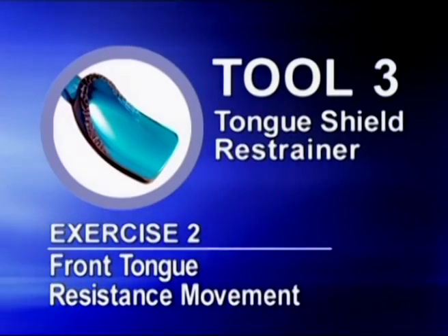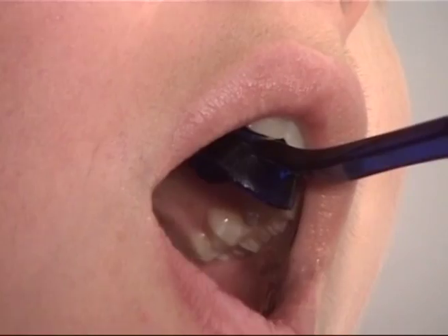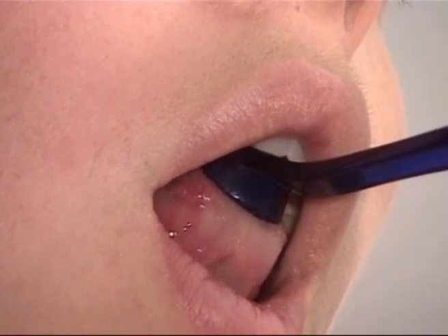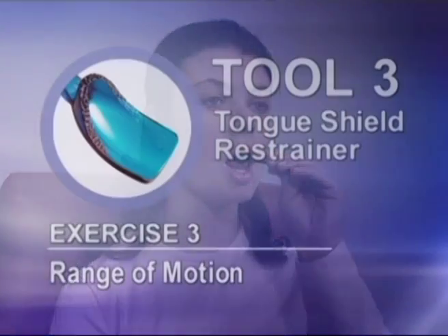The goal of exercise protocol 2 is strengthening. Place tool number 3 on the palate behind the front teeth. Elevate the tongue tip against the concave section of the ridge. Maintain pressure against the ridge until fatigue. Record patient's ability to apply tongue tip pressure until fatigue in number of seconds.